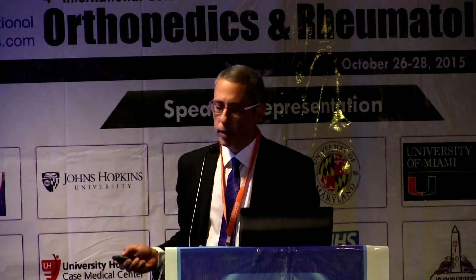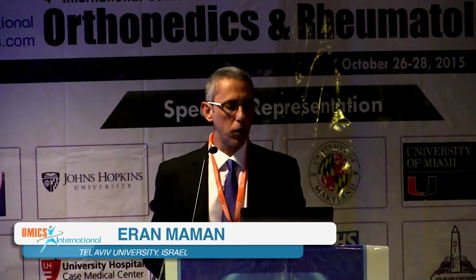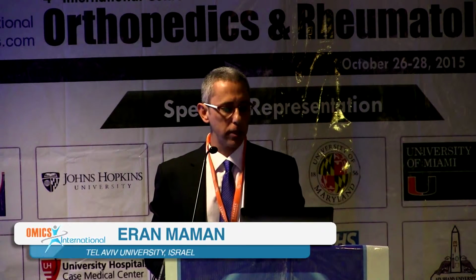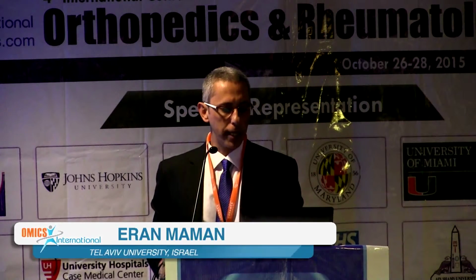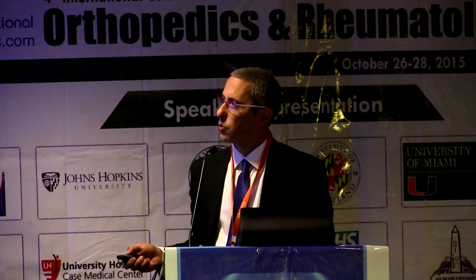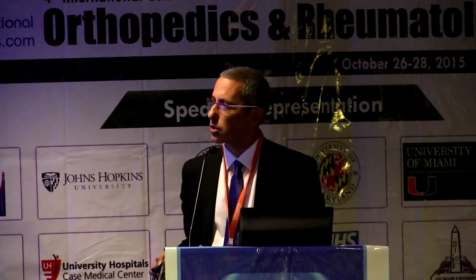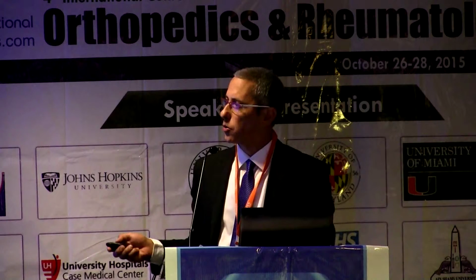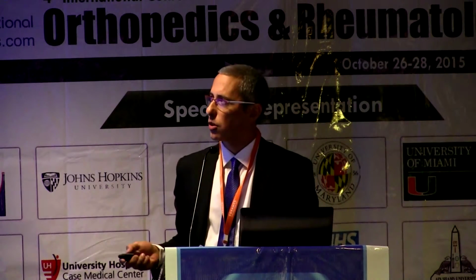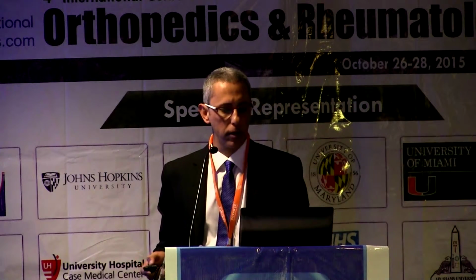The one from Slovenia, this is the first study that was conducted. The objective of this study was to examine the safety and the performance of the InSpace, and the inclusion criteria were massive tear or irreparable tear that failed conservative treatment. It was a prospective study, started in 2008, 24 subjects, 20 were irreparable, 2 were partial tear that haven't been repaired, and 2 massive rotator cuff tear.